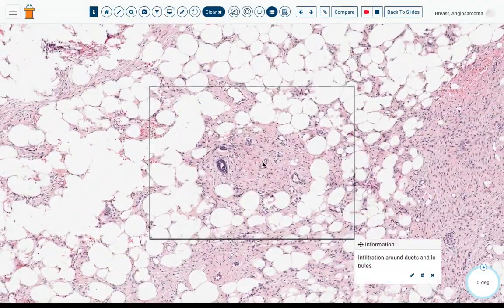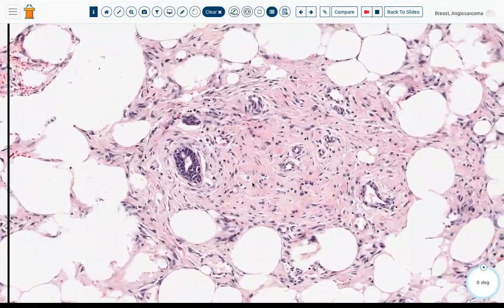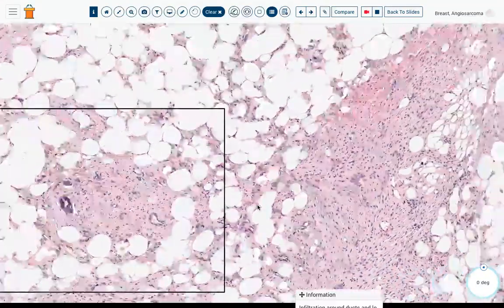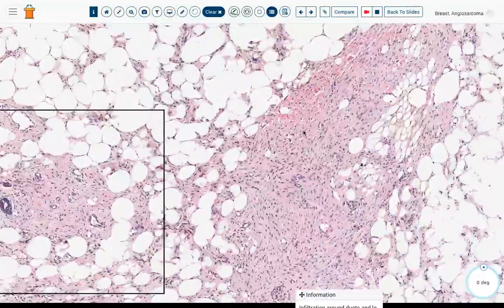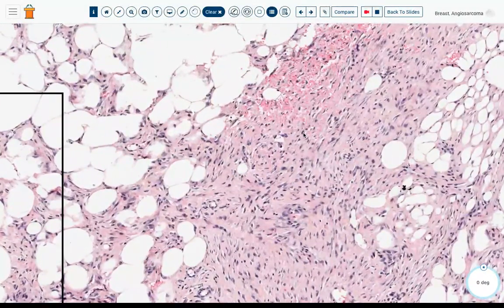You also want to note that the lesion is infiltrating around normal breast tissue, so certainly any benign blood vessel forming lesion would be out of the question, like a hemangioma. So this is clearly a malignant spindle cell lesion. You would use immunohistochemistry along with the appearance that there are vessels in here, although they are poorly formed. There's maybe a little blood lake. That this is truly arising from endothelial cells.